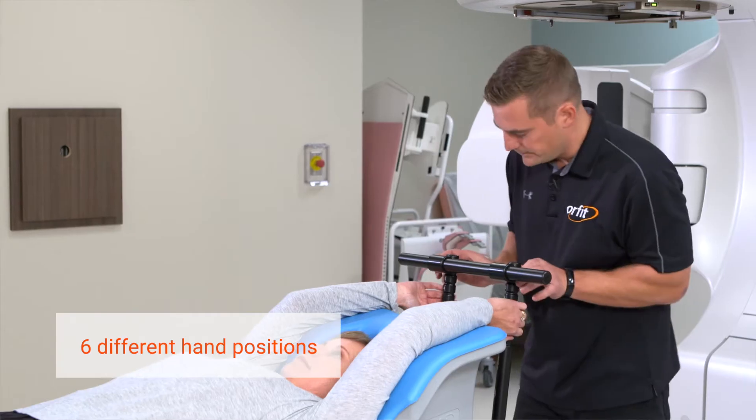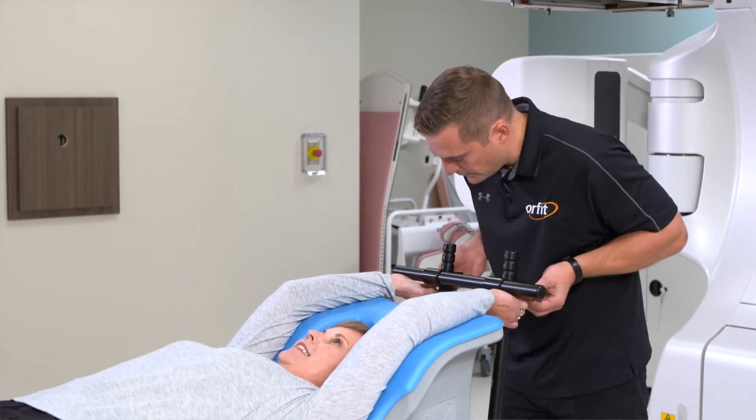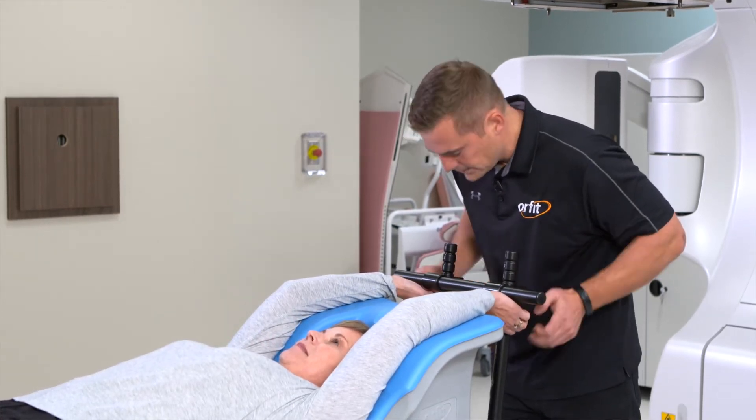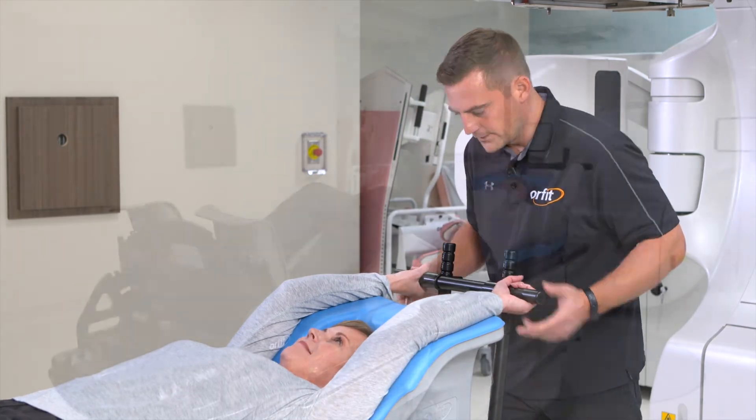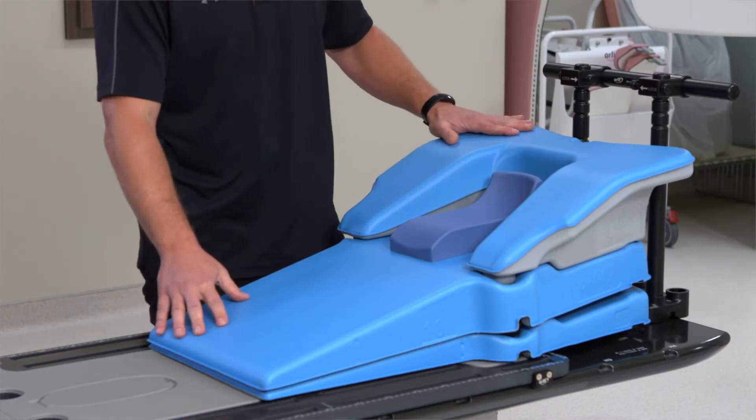For the hand grips, we have multiple different hand positions and hand grip devices that you could use depending on how far you want your patient to position their arms and what they can achieve comfortably. The benefits of having a low arm support as opposed to a tall arm support are patient comfort, or if you need to get through a small bore CT.